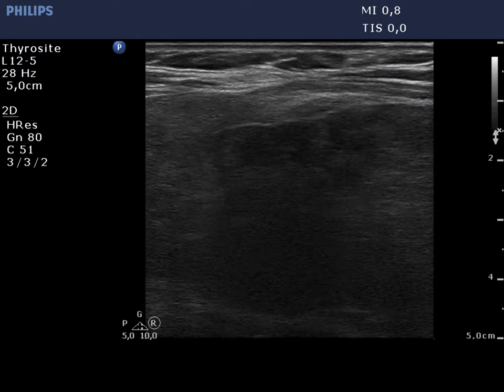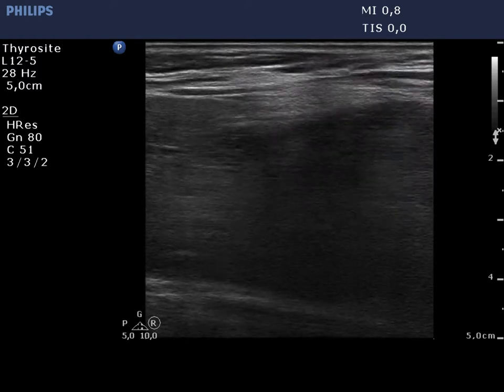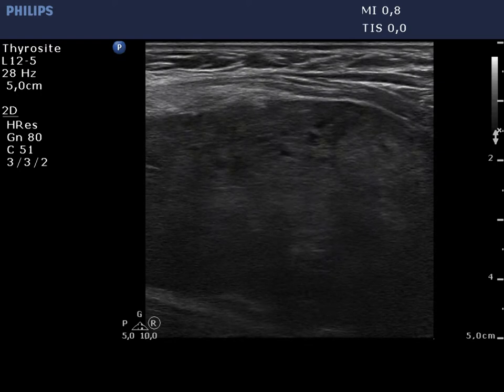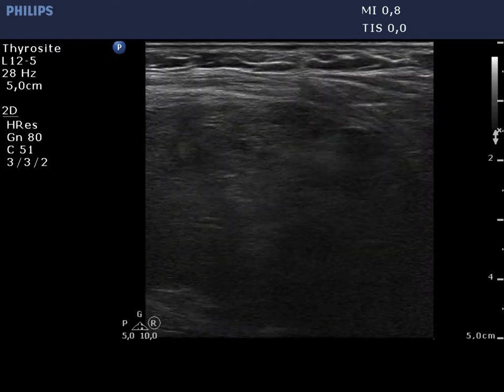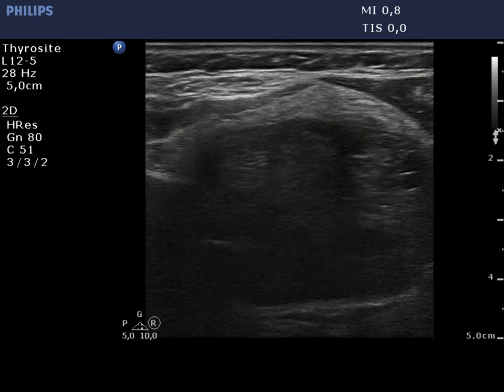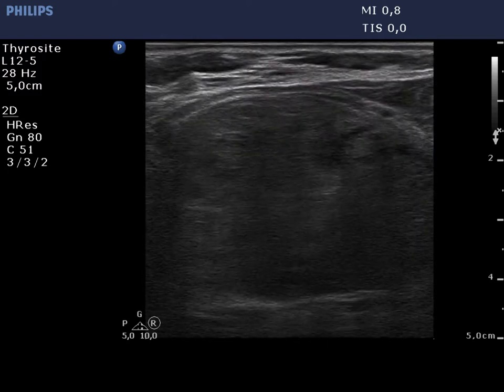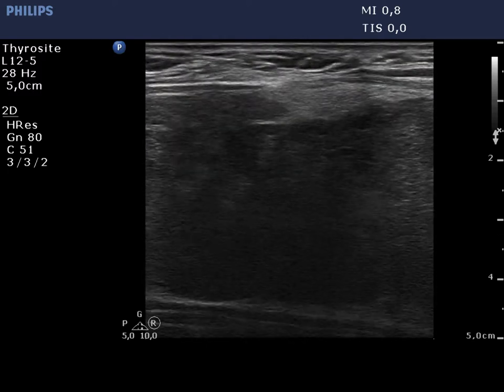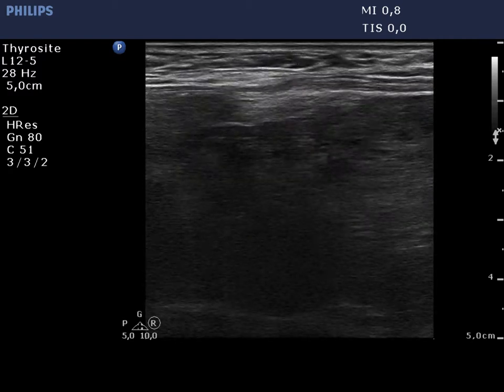The left thyroid has a similar appearance. It has to be avoided to misinterpret the hypoechoic areas as nodules in a pathological sense. Note the presence of fibrosis.